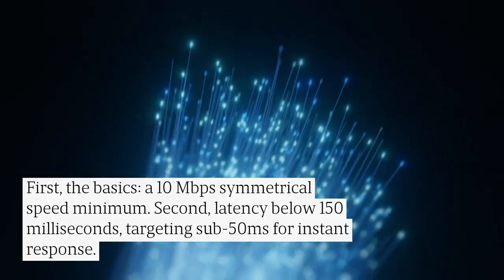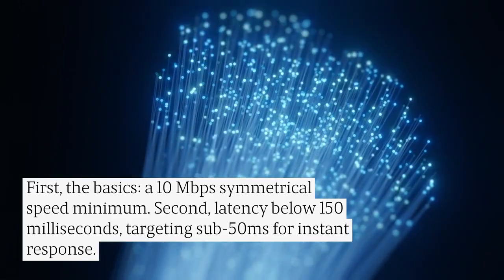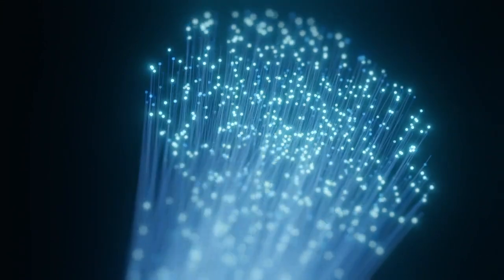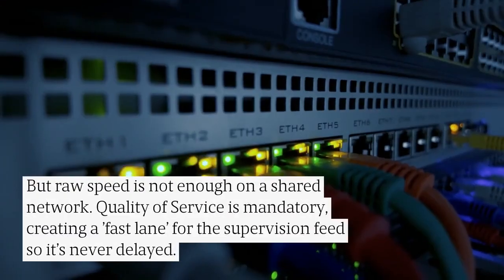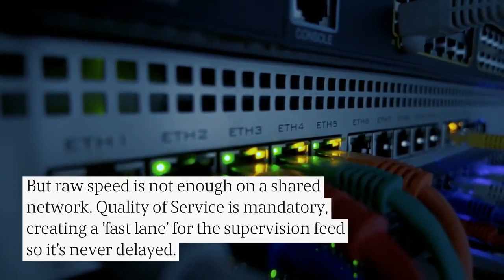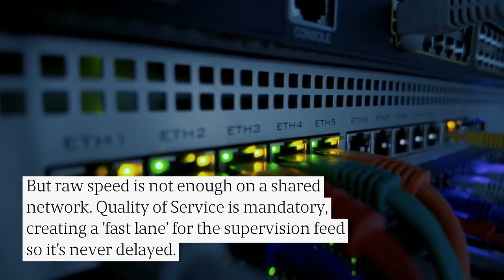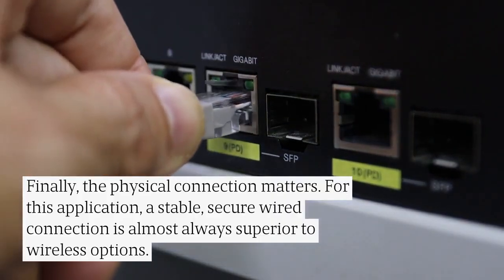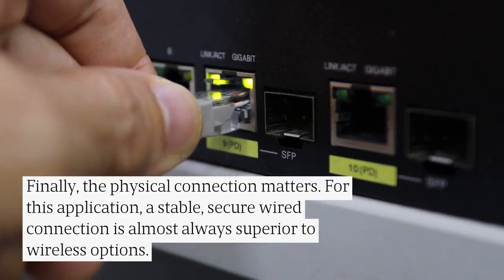First, the basics. A 10 megabits per second symmetrical speed minimum. Second, latency below 150 milliseconds, targeting sub 50 milliseconds for instant response. But raw speed is not enough on a shared network. Quality of service is mandatory, creating a fast lane for the supervision feed so it's never delayed. Finally, the physical connection matters. For this application, a stable, secure, wired connection is almost always superior to wireless options.